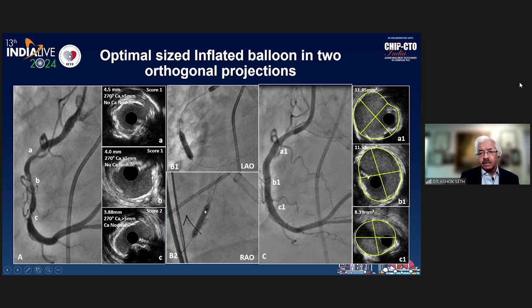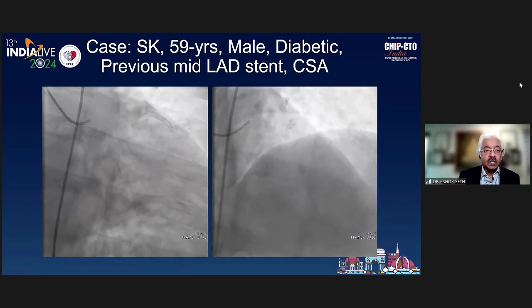You can see extensive calcification here. Stented, followed by high pressure implantation. You can see that the vessel is larger compared to the normal vasculature on both sides. Of course, this was IVUS guided, but this is just to show you that if you did not have IVUS, this is the sort of result that you want to achieve. And of course, the lumens were greater than 8 and 9 all over.